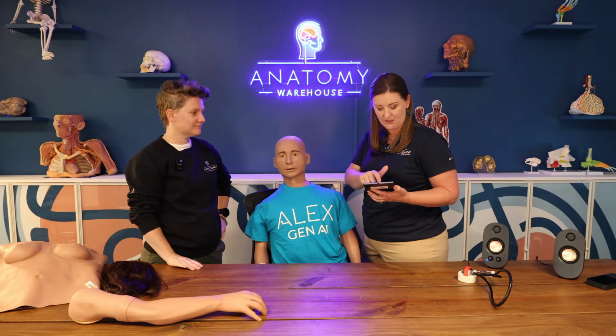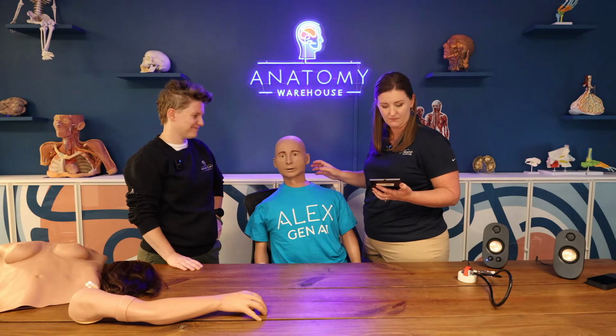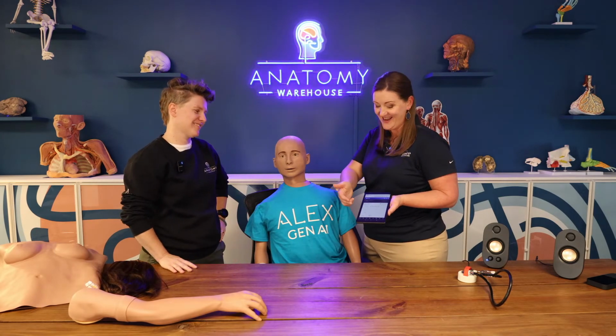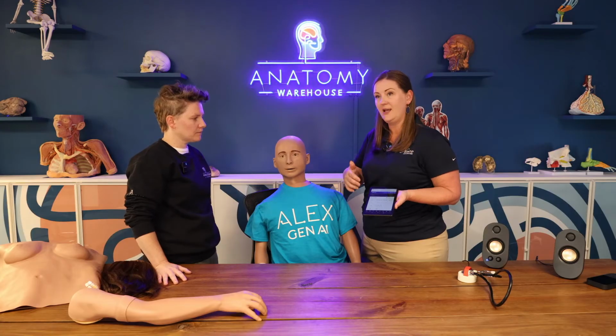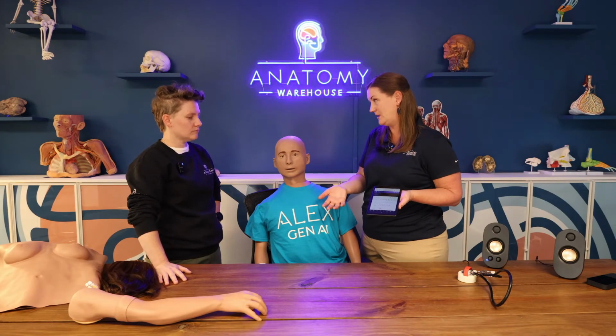So let's see about Andrew P. Landry. My fingers didn't want to pick him and get him going. So switching between patients is relatively easy. I've been watching it. It looks really easy. Yeah, switching between the patients is relatively easy. The mannequin comes with 4 patients pretty standardly, and then the AI software also gives that customer the ability to change and edit and make those patients be who they need them to be.